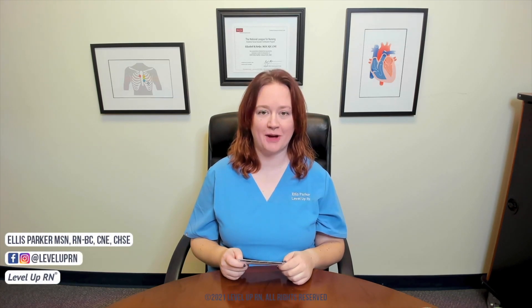Hi, I'm Ellis with Level Up RN. In this video, I'll be demonstrating how to perform a central line dressing change. I'll be following the steps that we've included on our clinical nursing skills deck. So if you have this deck, grab these cards and you can follow along with me. If you don't have the deck, you can check it out at leveluprn.com.